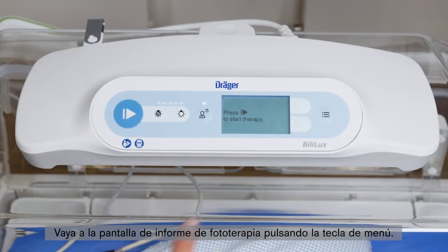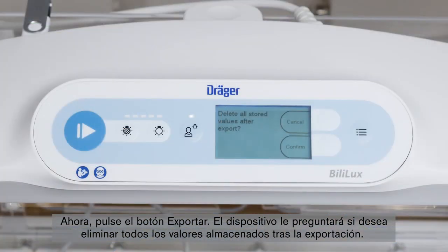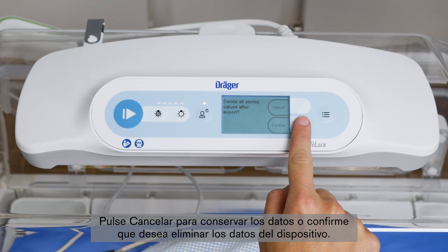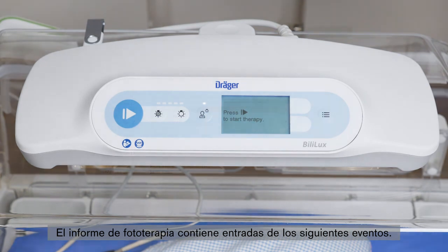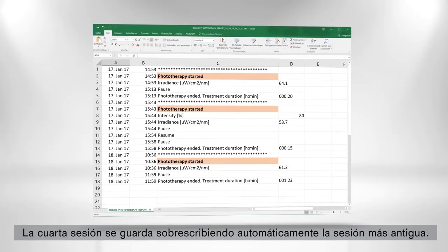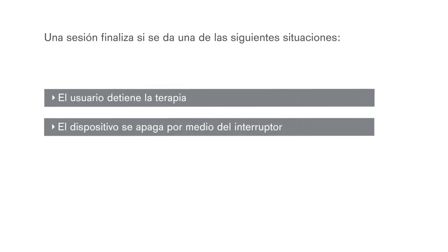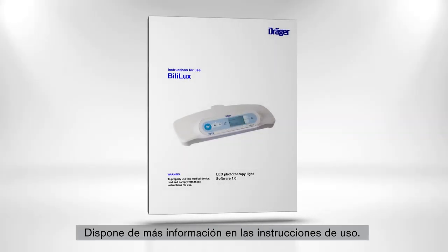Go to the phototherapy report screen by pressing the menu key, then press the export button. The device will ask you if you want to delete all stored values after export. Press cancel to keep the data, or confirm to delete the data from the device. The Bililux can record up to three phototherapy sessions in one report, with each session holding up to 30 entries. A fourth session will automatically overwrite the oldest session. A session will end if therapy is stopped by the user, the device is turned off via the on-off switch, or the device loses power for more than 10 minutes. Further information can be found in the IFU.